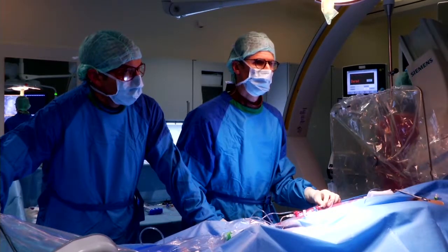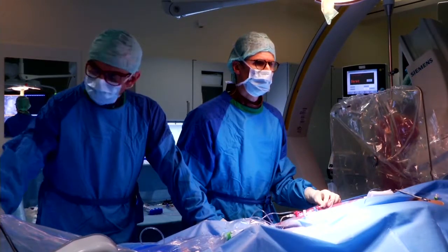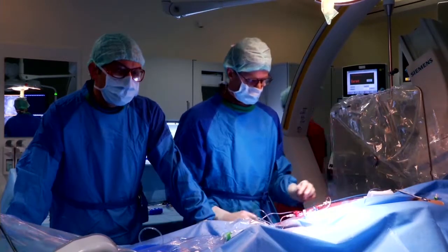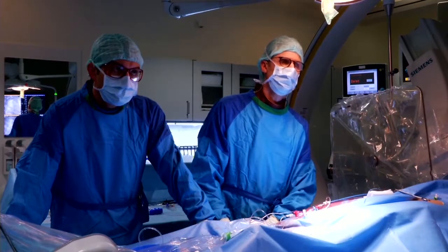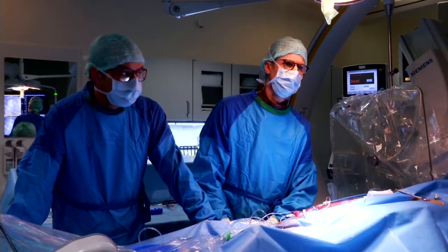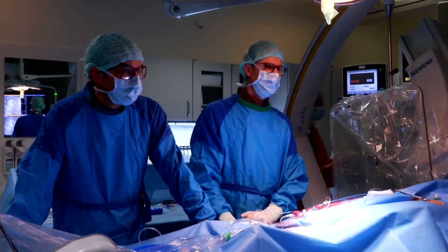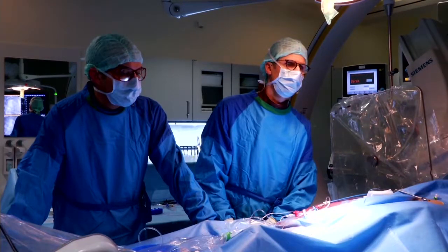So for the transverse arch, I always put a stiff wire in the ascending aorta. If I'm unhappy about stability, then I would use fast pacing at the same time. But for the transverse arch, I never use the subclavian because you never know how the balloon is going to work out, and it will milk out into the descending aorta. On the second point, I agree 100% with Shaq Qureshi about putting another stent, like a V, which will abolish the gradient and protect the left subclavian.